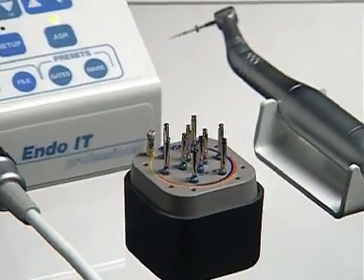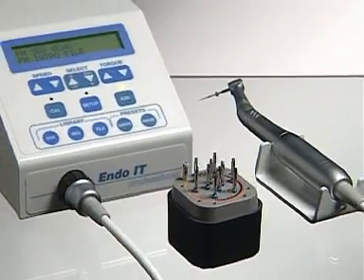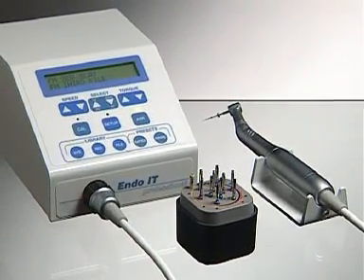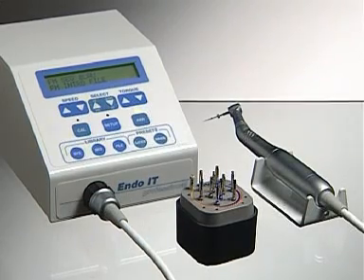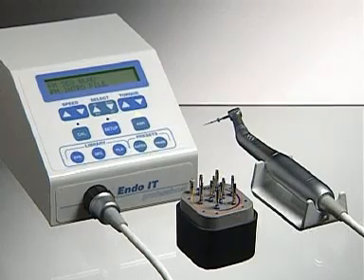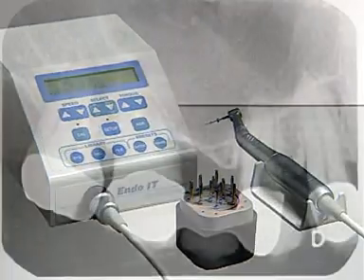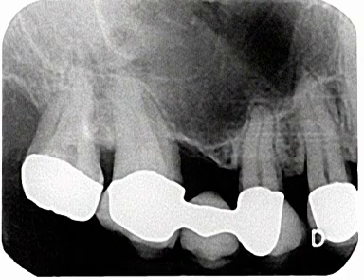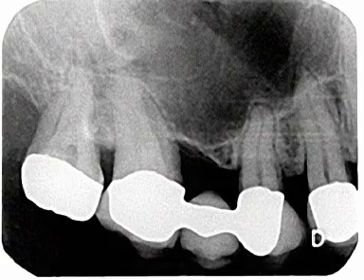In the case shown here, the FLEXMASTER NiTi file system is used together with the EndoIT Professional motor in the crown-down technique. The tooth being treated is the upper right 7, which has 4 roots, not all of which can be seen on the X-ray.